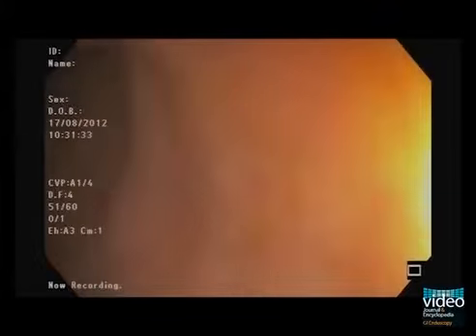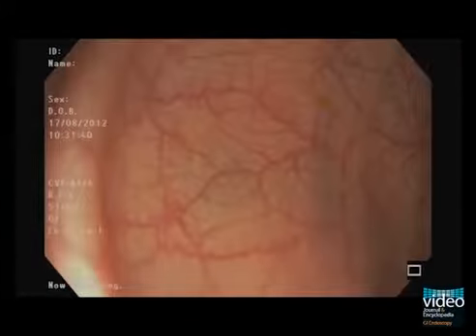The sigmoid colon can be stretched up to 80 centimeters, but can crumple down to 30 centimeters when the scope is straightened. Conforming to the pelvis, it passes anteriorly before moving posteriorly to the left paravertebral gutter, often producing a clockwise spiral loop.